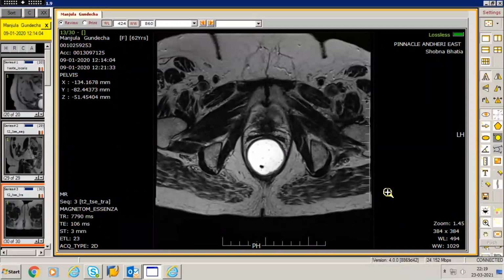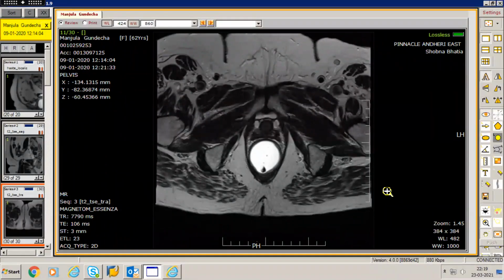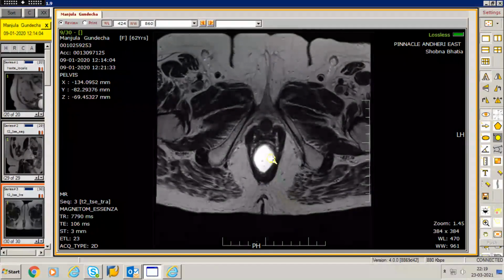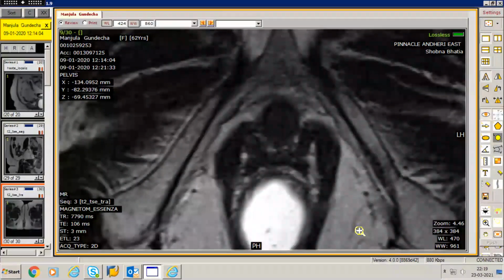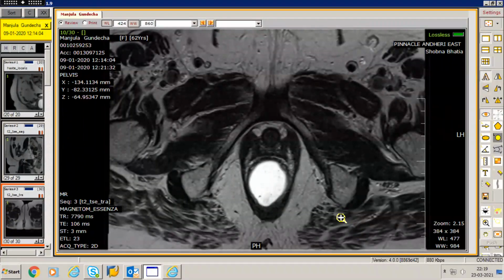So let's go down further. Down one more and magnify this image. So everybody remember this appearance of the vagina. It's typically got that horseshoe or H-shaped morphology which you have here. So the lack of symmetry of that horseshoe is usually an indicator that there's an endopelvic fascial abnormality, and especially if there's blunting and there's posterior protrusion, you need to look at this very carefully.